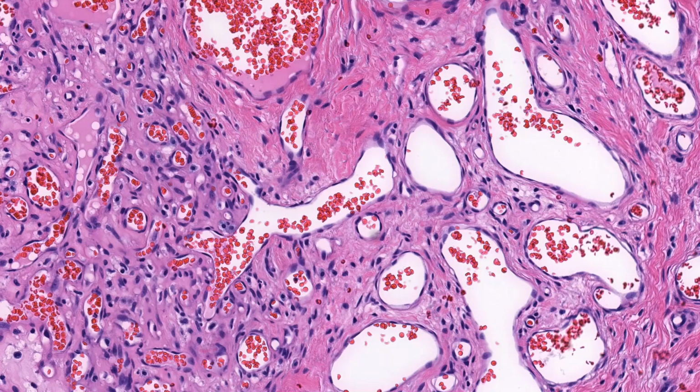This is an example of a lobular capillary hemangioma, a benign vascular lesion that most commonly arises in the head and neck, including mucosal sites. A minority of cases are associated with trauma or pregnancy. These lesions usually do not spontaneously regress, except in some pregnancy-associated cases, which resolve following delivery.